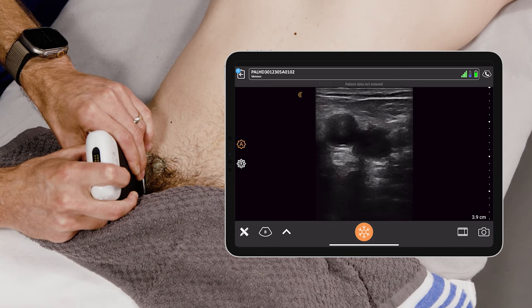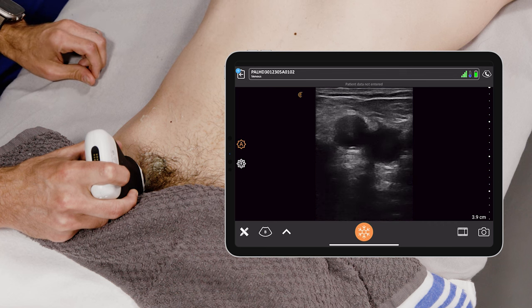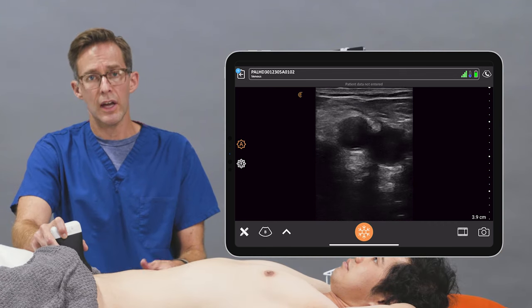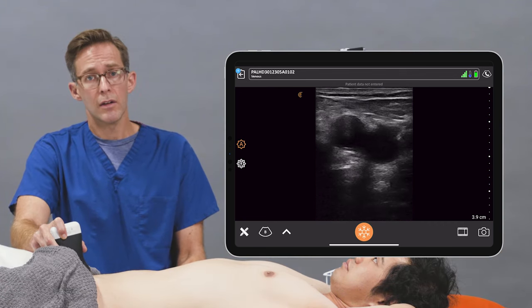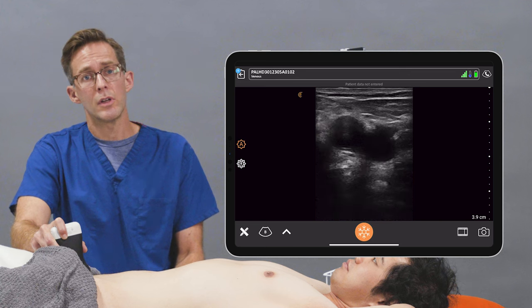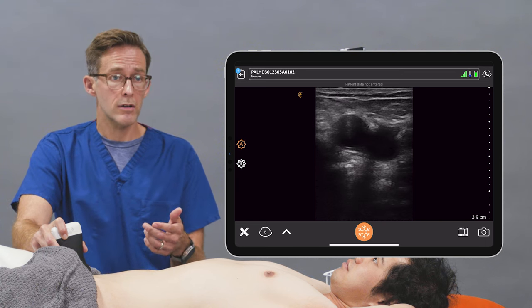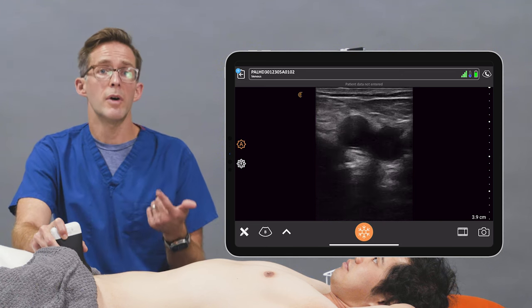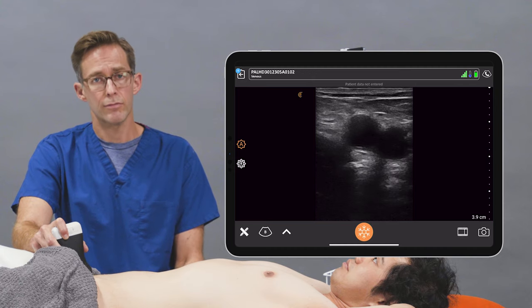To cannulate, you'll be working on a short axis view. You'll use sterile precautions and a normal Seldinger technique for a femoral central line. Ultrasound affords you better accuracy and minimizes complications. Thank you.